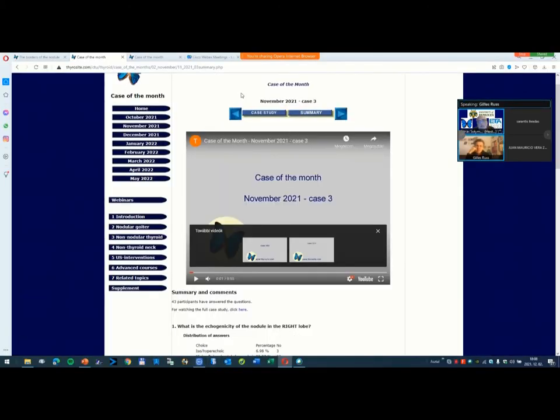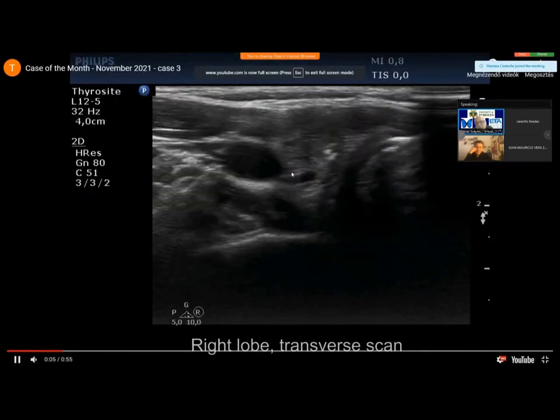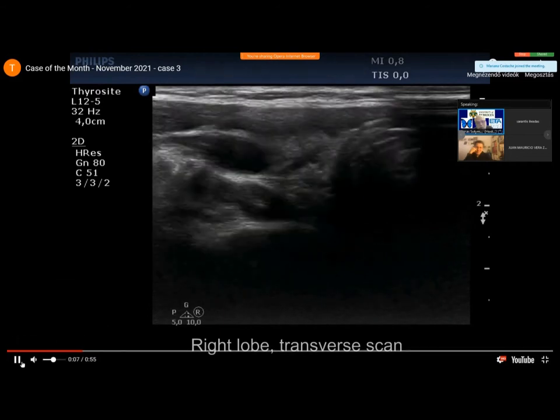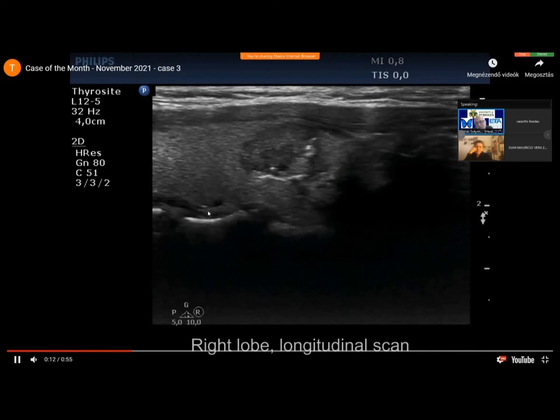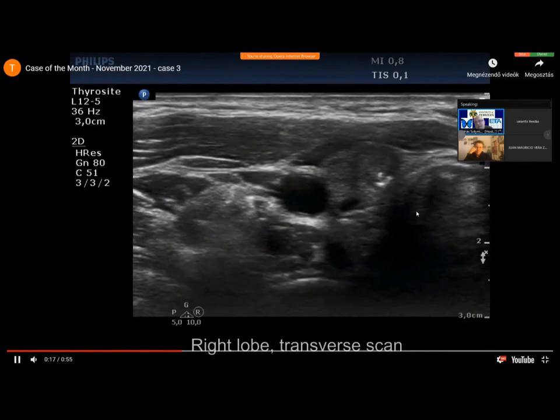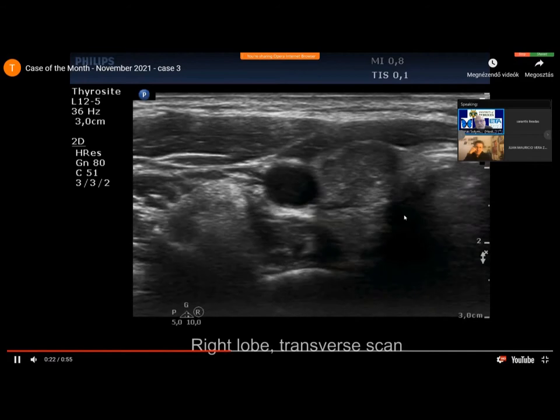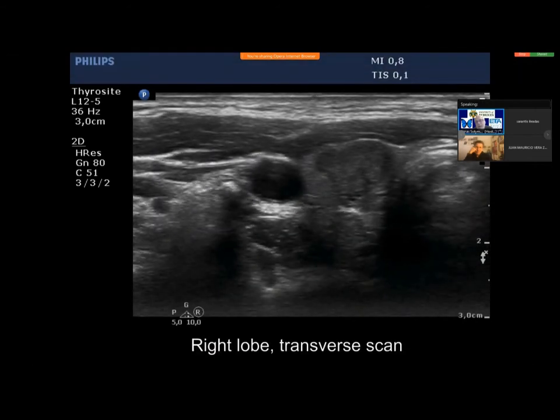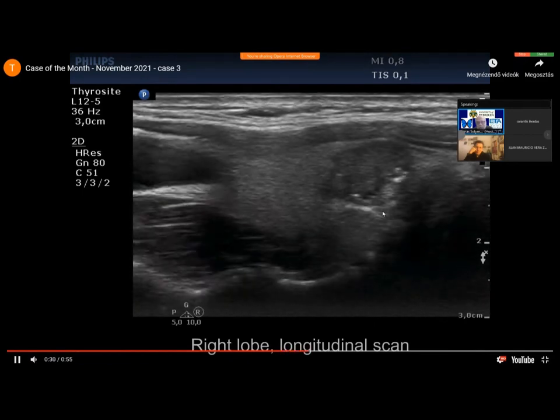Did you get the cytology result or the histological result? Yes, this was a papillary cancer. And turning to today's topic, this nodule has irregular lobulated margins. This was not enlisted among the seven cases — this was the case of the study in November — but it is clearly a lobulated margin. I think it is no question that this nodule has irregular borders, and it proved to be a papillary cancer.